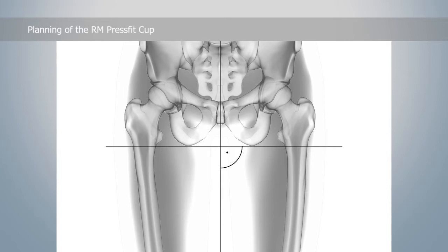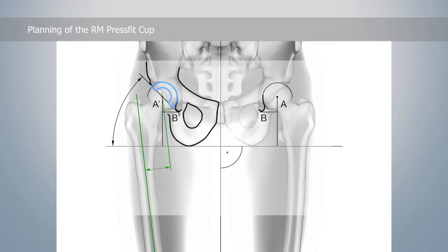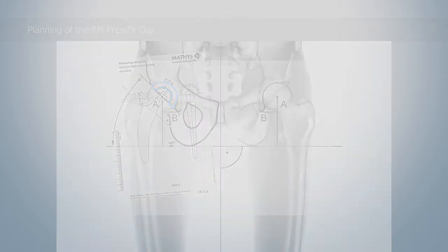Before implantation of a hip endoprosthesis, it is recommended to plan this on an X-ray image. This is done by either analog or digital means. Here, not only the shape and size of the planned prosthesis model should be considered, but also the desired reconstruction of the anatomy, including leg length and offset, if necessary, also on the second plane.